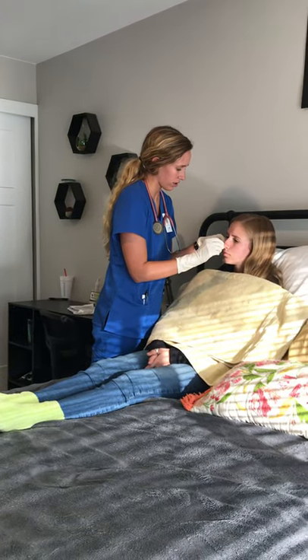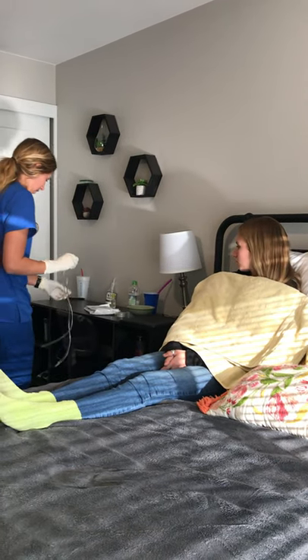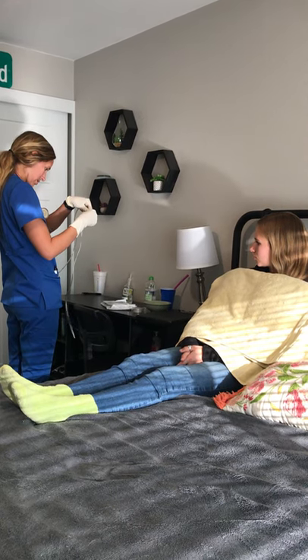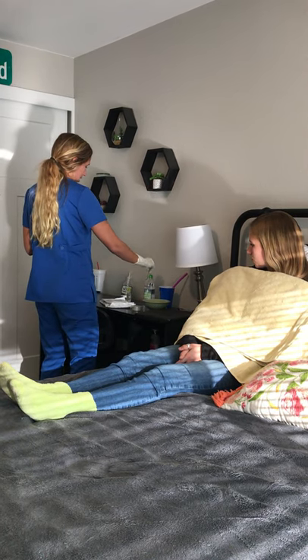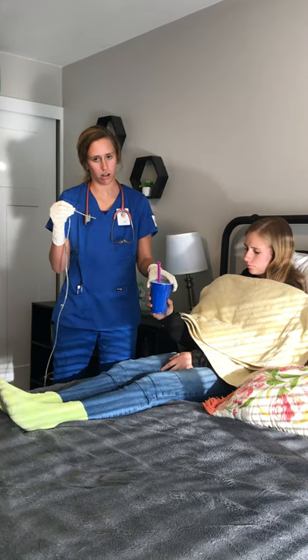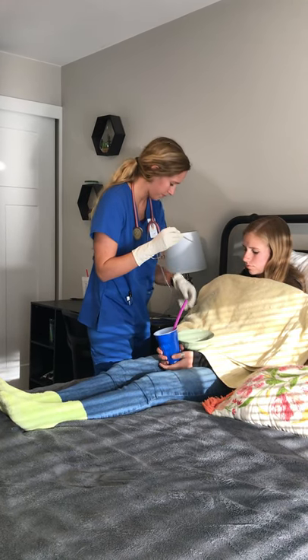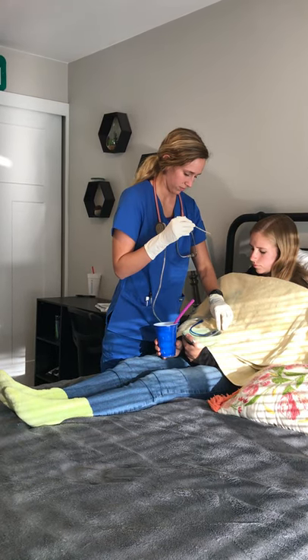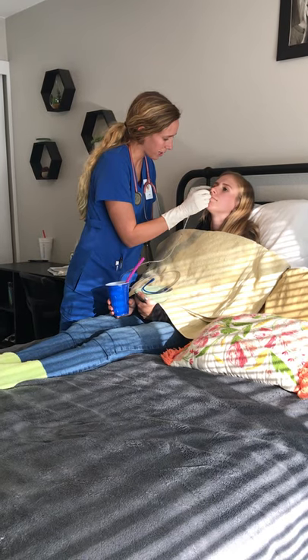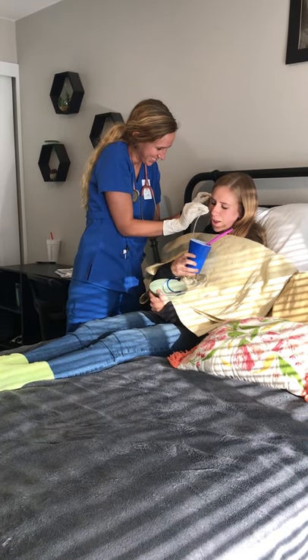Now I'm going to measure: your nose, tragus, and down to your xiphoid process. I'm going to take a piece of tape and mark where it is. Now I'm going to lubricate it and hand you this. My patient is going to be my helper since I don't have an extra person this morning. I'm going to have you tilt your head all the way back. I'm going to start putting it in. Once I see it in her oral cavity, I'll have you tuck your chin down to your neck. Go ahead and start sipping your water for me.